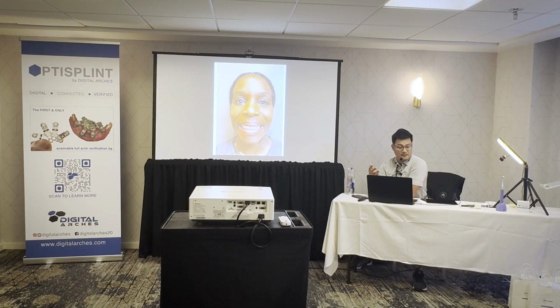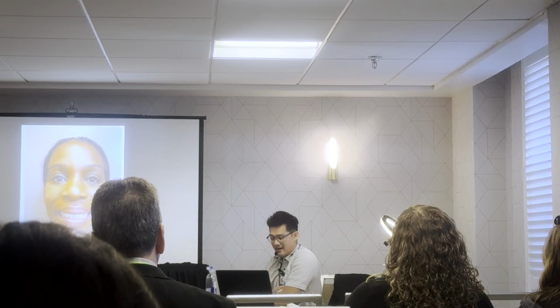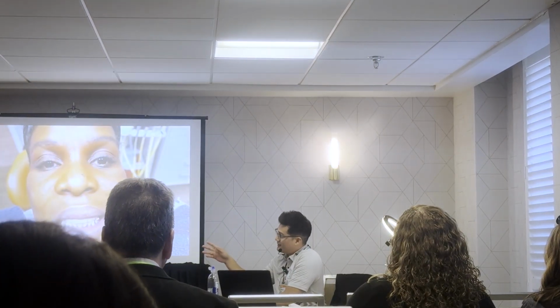We do zygomatic. She's a very, very dental phobic, high anxiety patient. And so for her, it was, hey, let's get this done as soon as possible. So she received 4 zygomatic implants, and we did an OPTISPLINT. She came back the next day, and I put in a printed temporary.